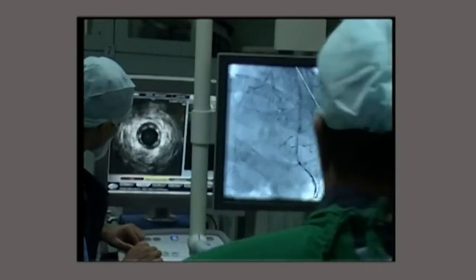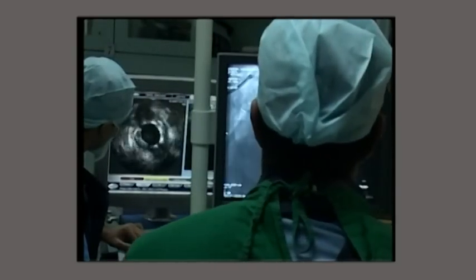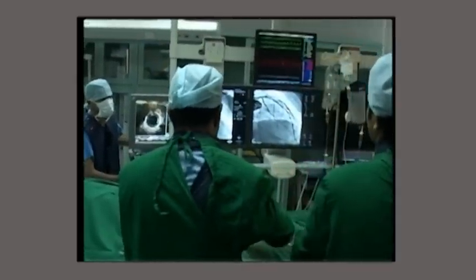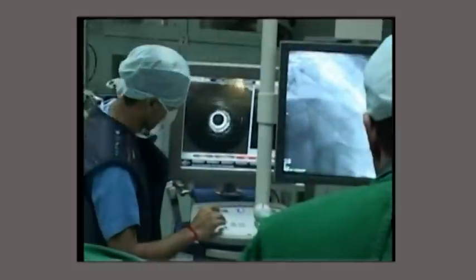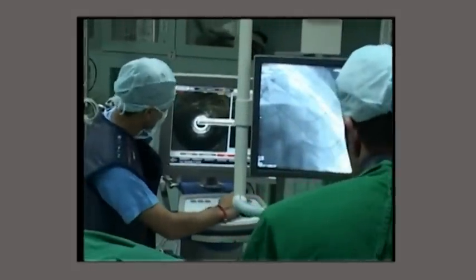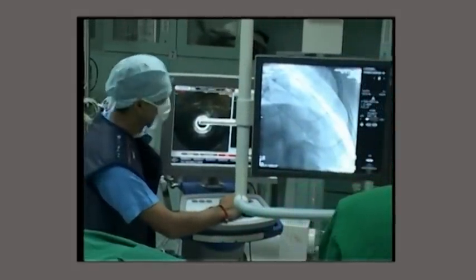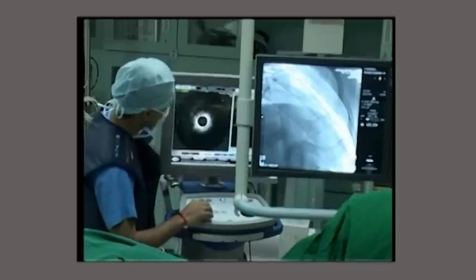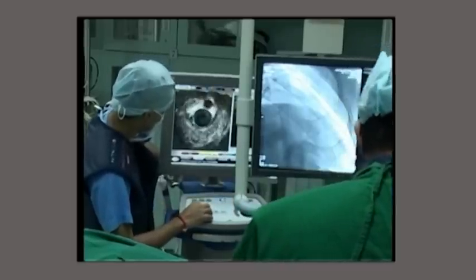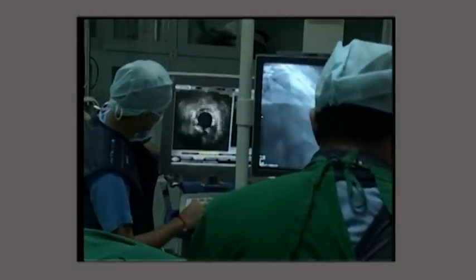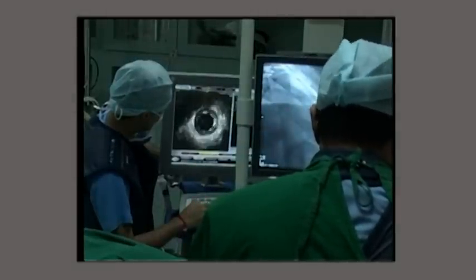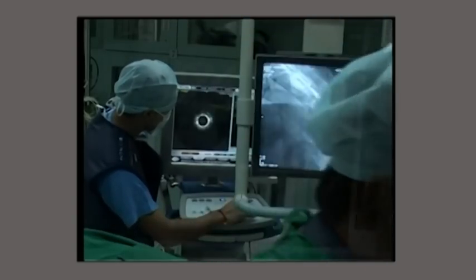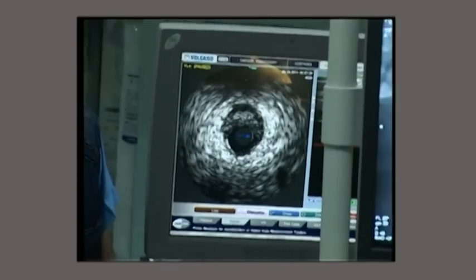After post-balloon dilatation, I took an IVUS image and this image shows the struts of the stent are now well opposed on the arterial wall — this is a perfectly well-deployed stent. Even on the coronary angiogram screening, the angiogram looks perfect in terms of stent deployment. This is the final image showing the struts of the stent extremely well opposed on the arterial wall.